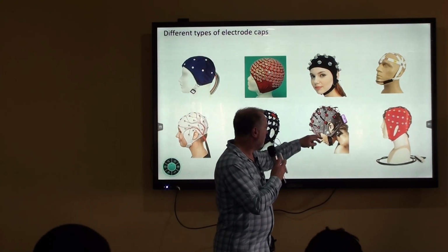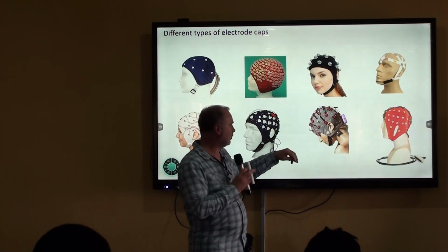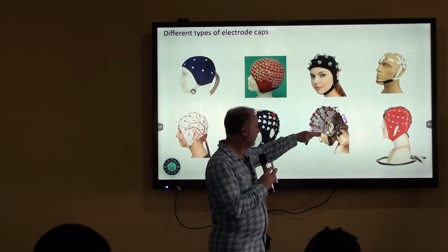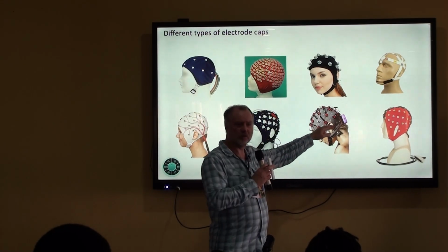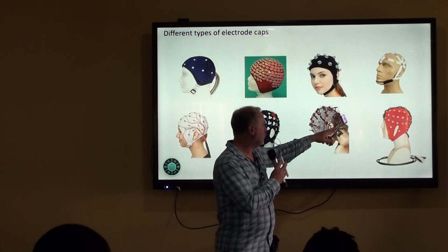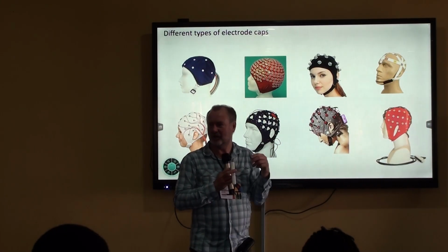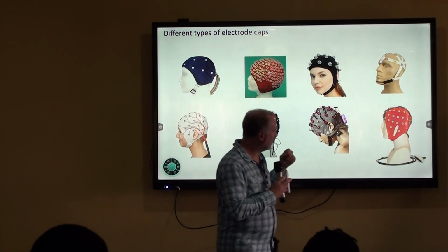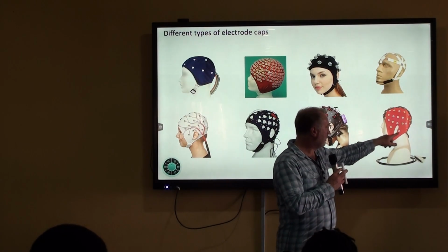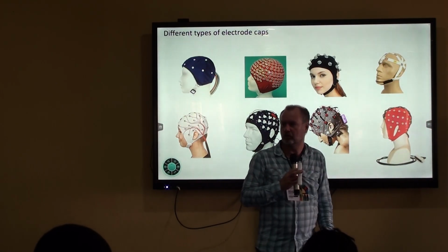With this cap, I think they've cheated a little bit for the photo, to make a nice photo out of this. This wire, I think, goes back and goes behind the ear. Usually this wire is basically running around it because this cap is using a reference electrode behind the ear. So I think they've just tucked it away to make the photo nice and clean. So this cap clearly has an electrode on the mastoid, and that's an electrode that you would use for the reference.